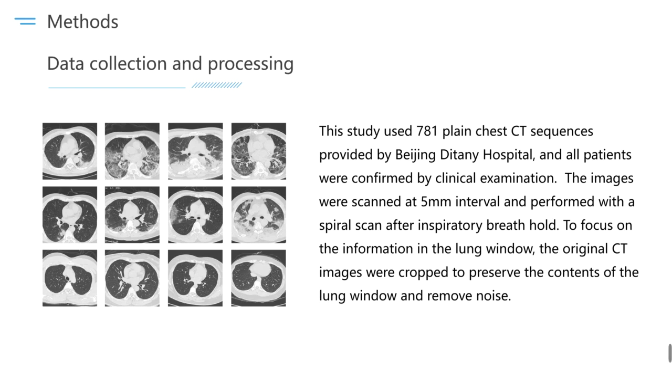The above figure shows the images in chest CT sequence of different pneumonia patients. The three rows show the lung images of bacterial, viral patient and healthy person from top to bottom, respectively.